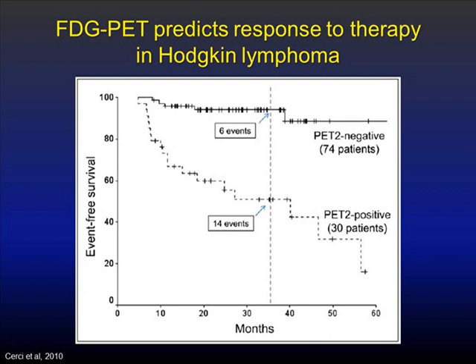And there's a great deal of interest in, after 2 cycles of chemotherapy in aggressive lymphomas, if someone remains PET positive, switching the chemotherapy to something that may work, and seeing whether we can get them back up to those PET negative levels. That's an example of what we do for patients. The data is coming in about switching chemotherapy, and this is an area where FDG-PET has been very successful.